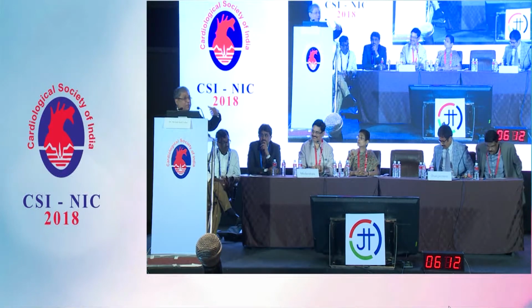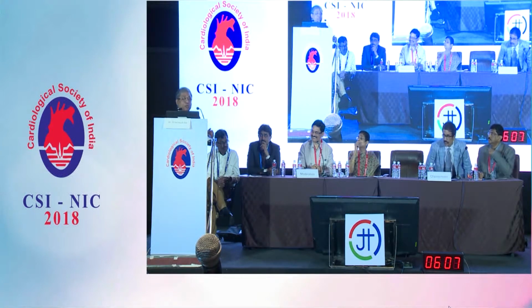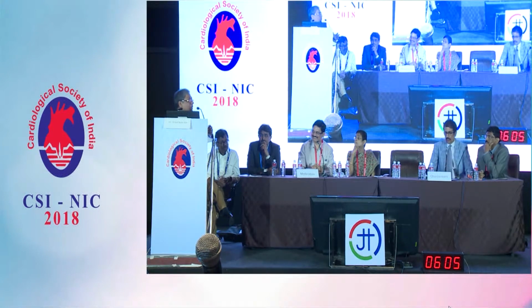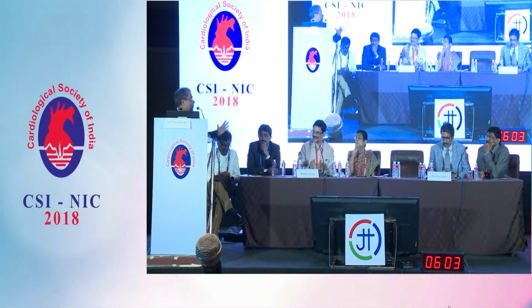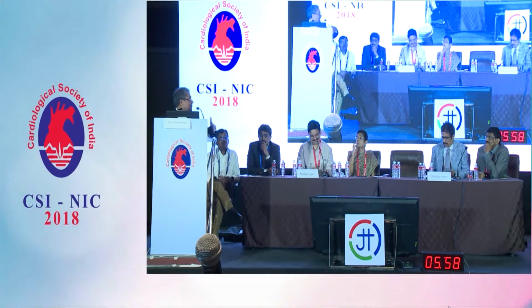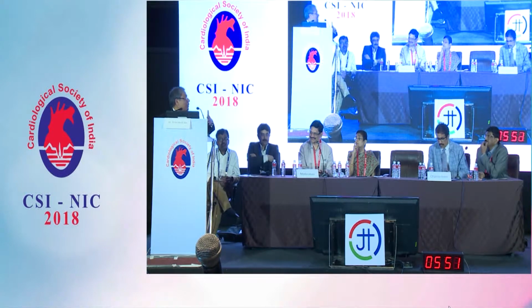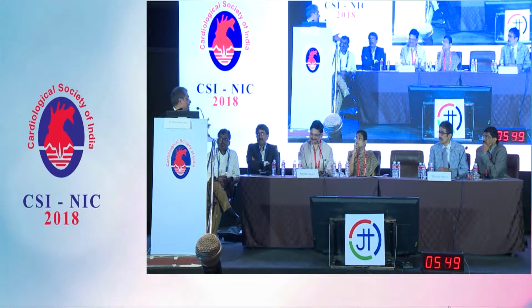Yeah, exactly. I completely agree with you. In fact, we used to do the same kind of thing earlier as well. We used to put the thrombosuction catheter and do the thrombosuction. But somehow or other, in one or two cases, we had some problems, acute, catastrophic problems also. So we thought that let us follow the guideline and straight away go for the balloon dilatation at different levels, and then come out with a simpler kind of treatment schedule in this group of patients.